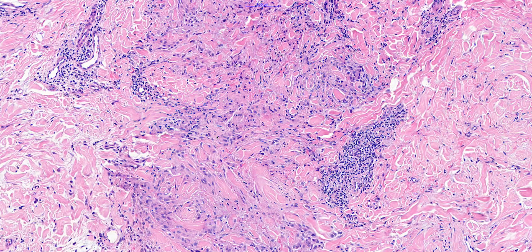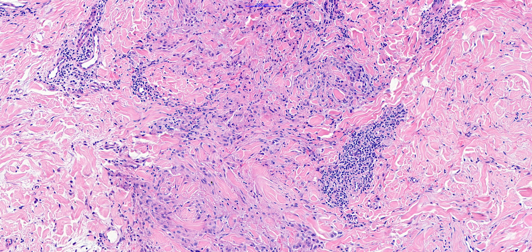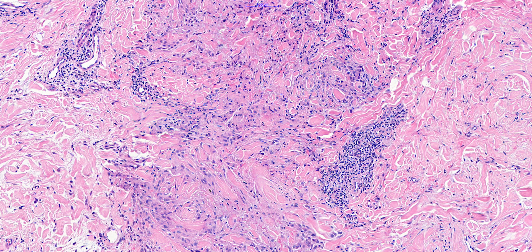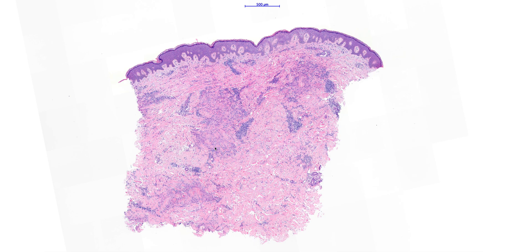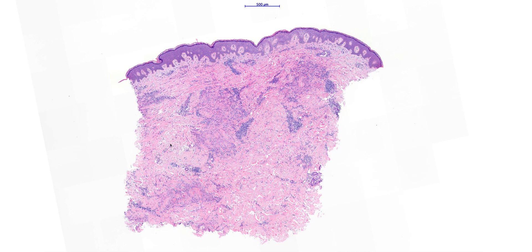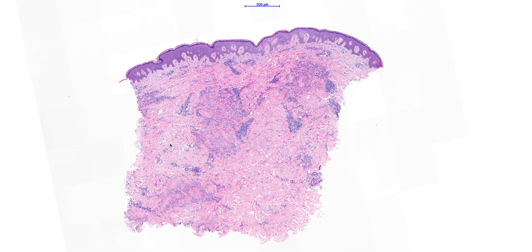In epithelioid sarcoma, rather than benign histiocytic cells, the cells are malignant and usually look more atypical and mitotic. If there's any doubt, immunohistochemistry is the easiest way to resolve the case. In epithelioid sarcoma, one would expect the malignant cells to stain with cytokeratins, co-express CD34, and to have lost INI1. Whereas in granuloma annulari, the cells are histiocytes and would stain for histiocytic markers such as CD68 or CD163, and not stain with cytokeratins or CD34.